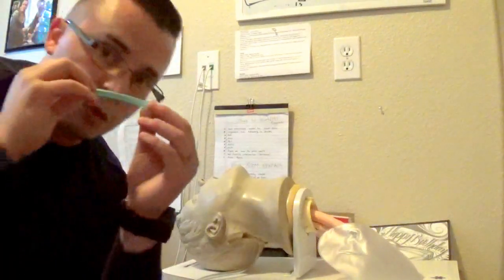You always want to go with the right nostril first — it's the bigger one. Go straight back; you don't want to go upward because if you go up you might go into the sinuses, and that's not good. There have been x-rays showing the NPA ended up in there — it looks pretty nasty. So go with the anatomy of the airway on the right nostril. If you do have resistance, you can put it in the opposite nostril — bevel side on the septum. Go straight back and you should be good.